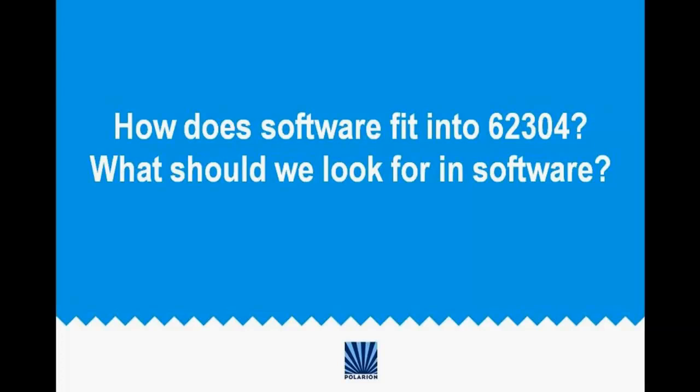Yeah, well, I think the question, again, was what kind of verification activities do you recommend to people? And so I'm just here looking at the 62304 standard, and there's a handy chart on page 27 of the standard that has a summary of what sections apply to what kind of class of software you're dealing with.